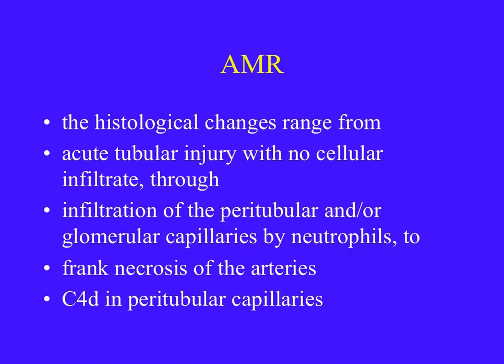The histological changes may range from simply acute tubular injury without inflammation at all, through to infiltration of the peritubular capillaries and/or glomerular capillaries by neutrophils, to frank necrosis of the arteries in the more severe cases, and may or may not show C4d deposition in the peritubular capillaries.